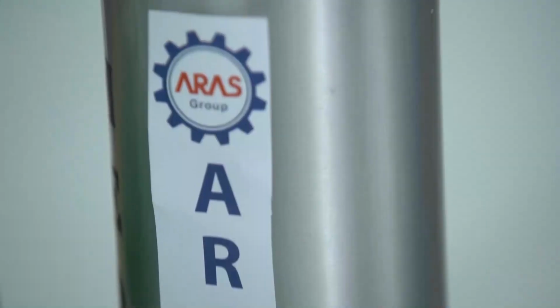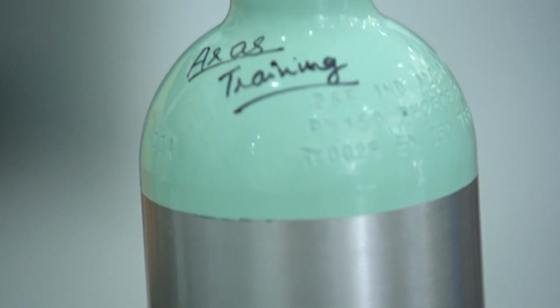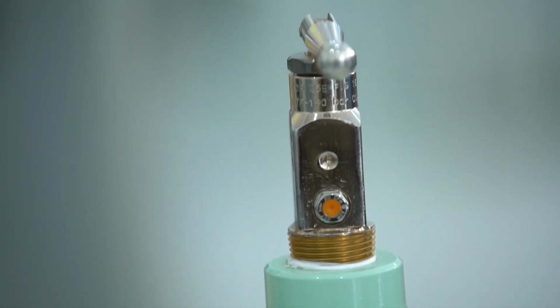Why are we talking about oxygen now? Because many times it happens that in the filling system, sometimes you will not find oxygen inside the cylinders. Sometimes we provide a regulator, but the regulator gauge is not working properly or has not been calibrated for a long time. Also, when using a cylinder we used before, we do not check the percentage of oxygen inside it.